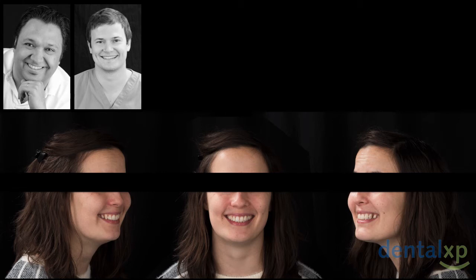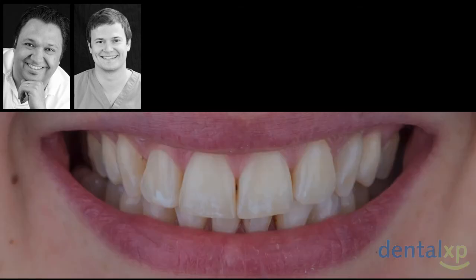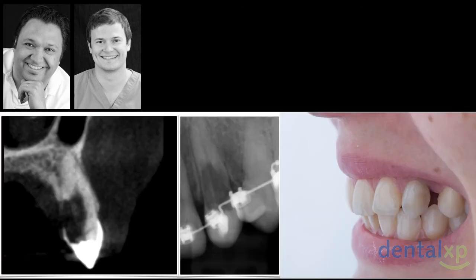This young lady comes because after she finished her ortho treatment, it was discovered that she has root resorption on tooth number 23. And you can see that here. It's a massive root resorption, but luckily for her, it's really localized palatally. So the whole bone buccally is preserved, the buccal plate is totally preserved. So we can look into extraction and immediate implant placement.